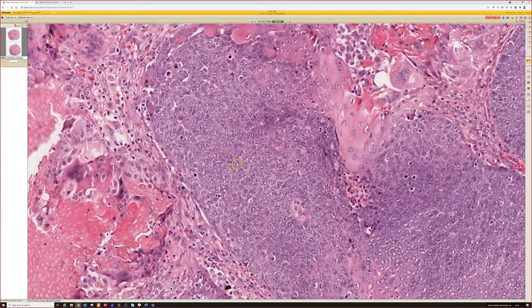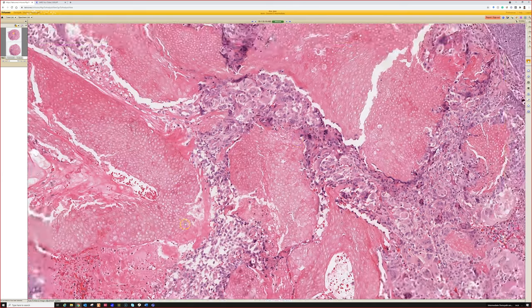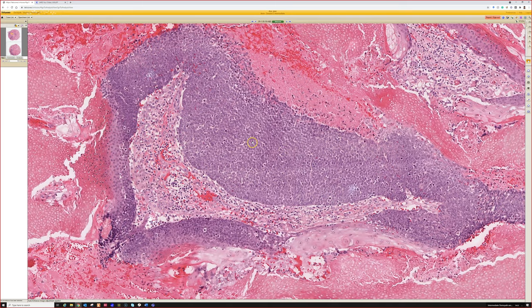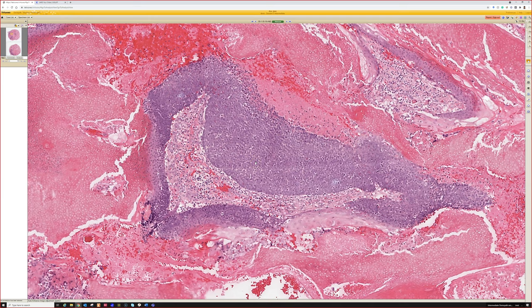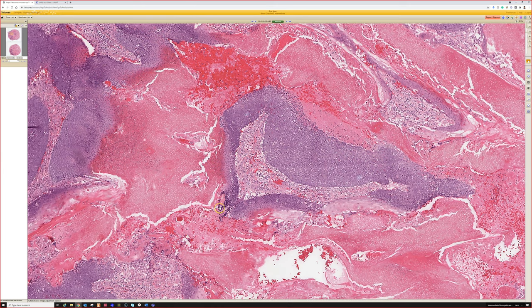I can't get the focus to show you here, but they have lots of mitoses, florid mitoses. Do not be afraid. That is okay. Unless I see dramatic pleomorphism or a lot of atypical mitotic figures, then I'm going to start getting worried. Usually the times I've seen malignant pilomatrichomas or matrical carcinomas have been in adults, and they've looked instantly like malignancy when I look at it, and then only later as I look around do I find some areas that have some matrical differentiation.